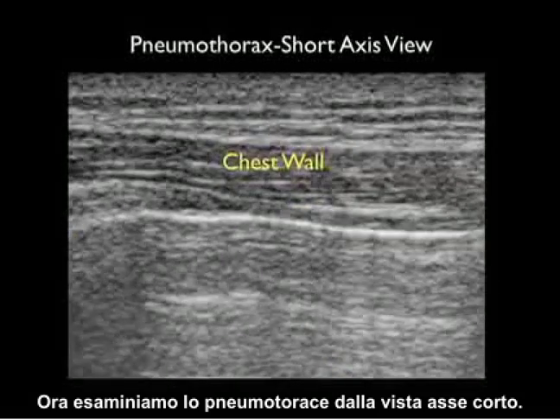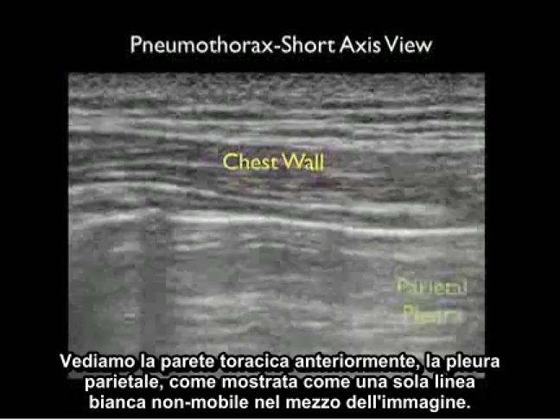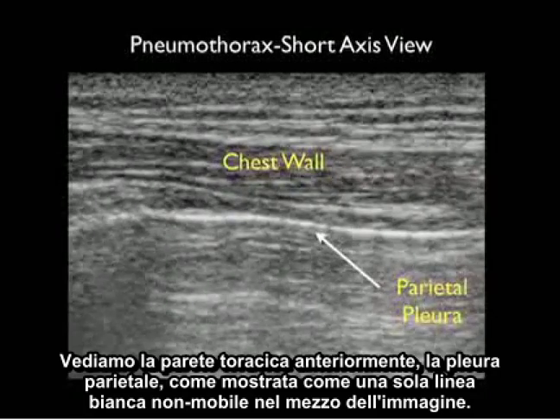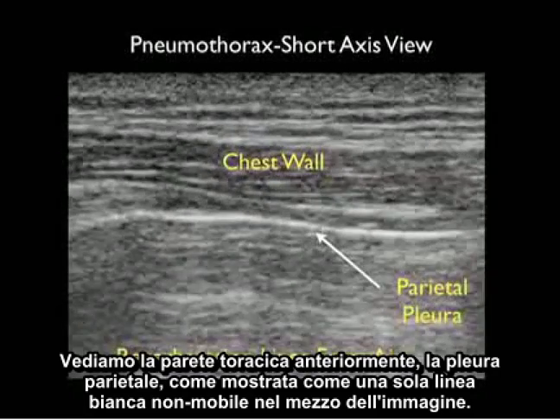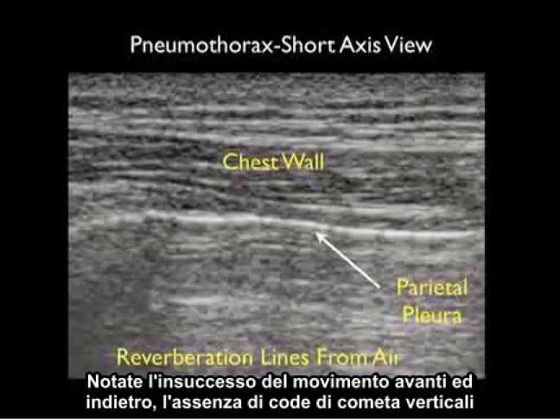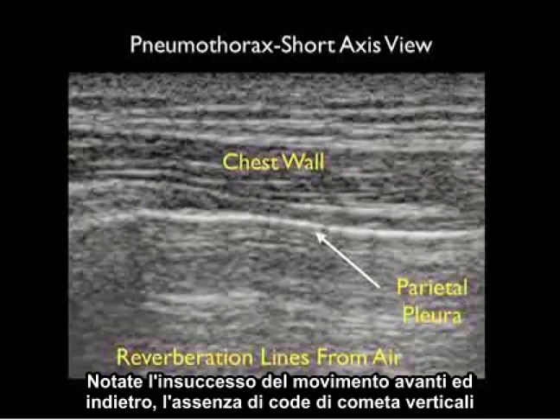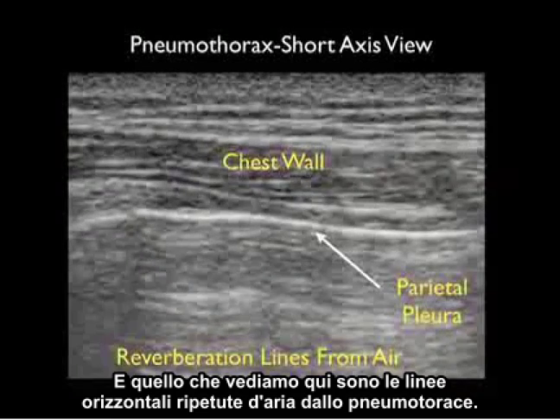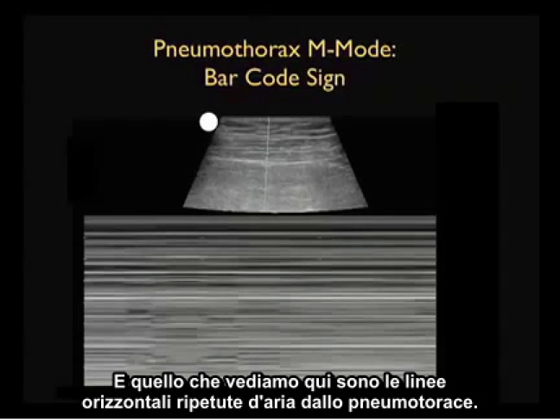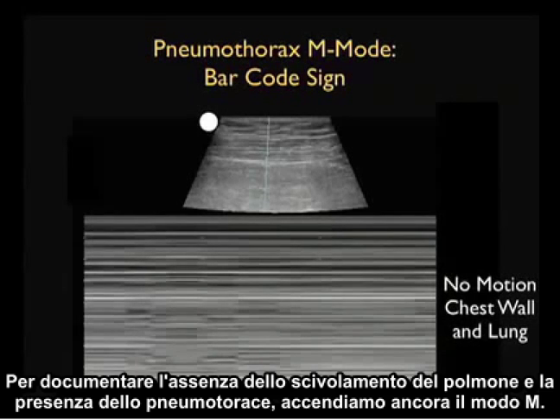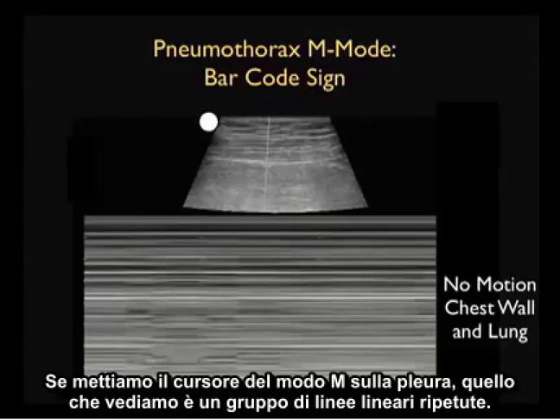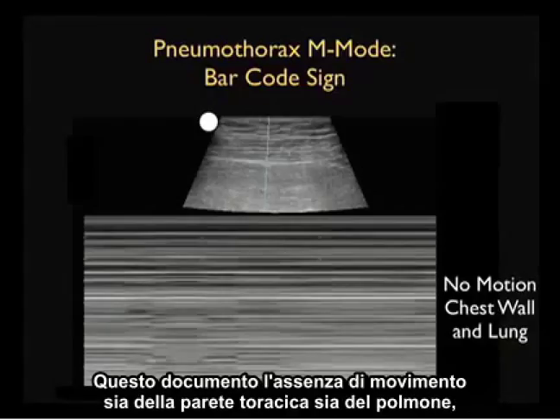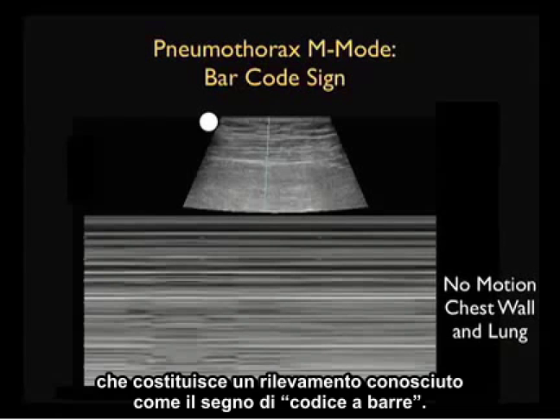Now let's inspect a pneumothorax from the short axis view. We see the chest wall anteriorly, the parietal pleura shown as a single non-mobile white line in the middle of the image. Note the failure of movement back and forth, the lack of vertical comet tails, and what we see here are repeating horizontal air lines from the pneumothorax. To document the absence of lung sliding and the presence of a pneumothorax, we'll again turn to M-mode. If we put the M-mode cursor down on the pleura, what we'll see is a set of linear repeating lines — this documents no motion of both the chest wall and the lung, making up a finding known as the barcode sign.